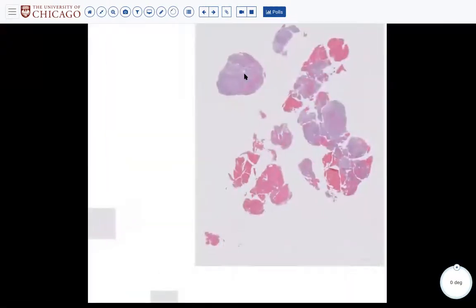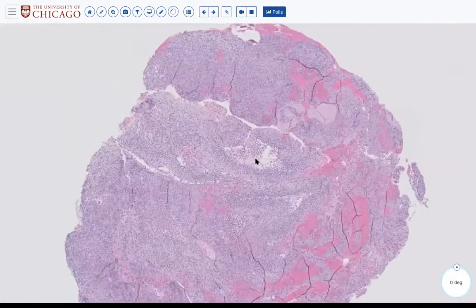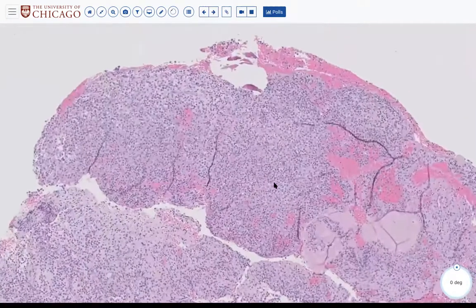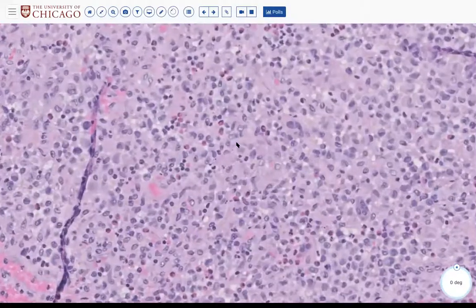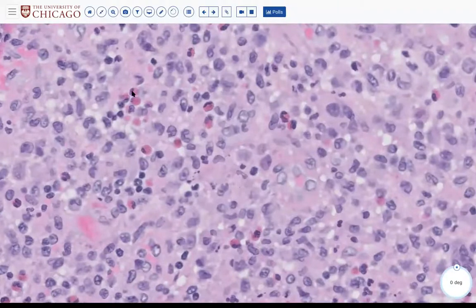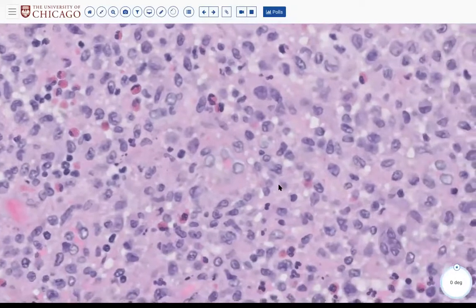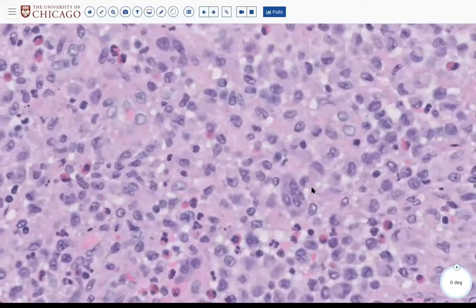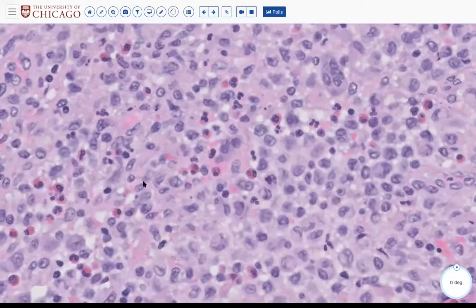Let's look at the permanent because that might be more obvious. But to those of you who thought about EG, well done. Maybe now it's a little more clear. Unfortunately, the eosinophilia of those EOs doesn't show up quite well on frozen. But if you look at the nuclear features here, oh, look, there's a little osteoclast-like giant cell. The nuclear features do recapitulate what we saw in the frozen, with the wrinkled kidney bean. Oh, there's a nice kidney bean shape right there, grooves.